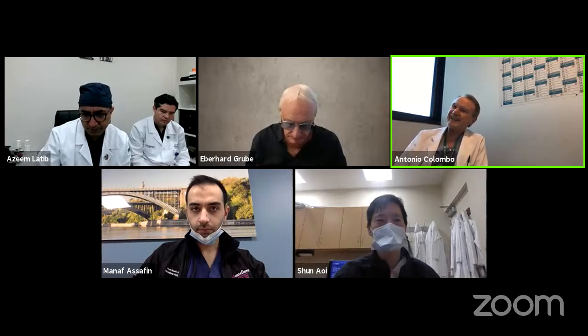But if I see that I don't have a good guiding catheter in that approach, if I am radial and the guiding catheter is not performing well, I don't insist. I say I do the intervention next day utilizing a femoral or a right or left radial, different. So poor support, and I don't believe I can overcome the poor support. A lot of dye, of course, and I have some suspicion.